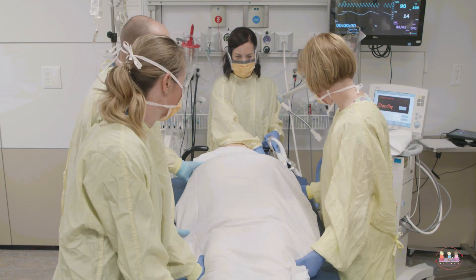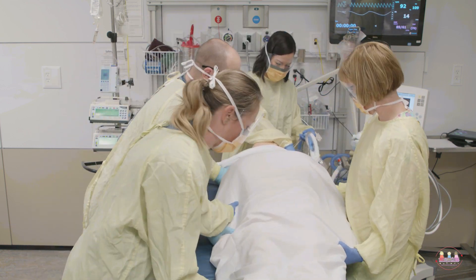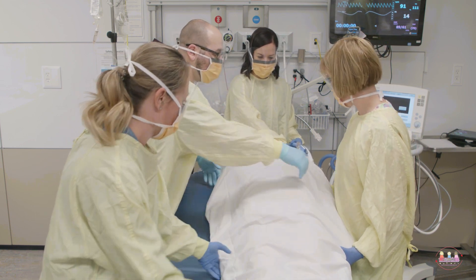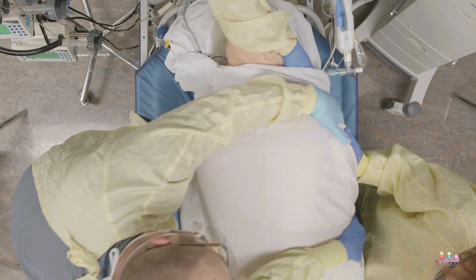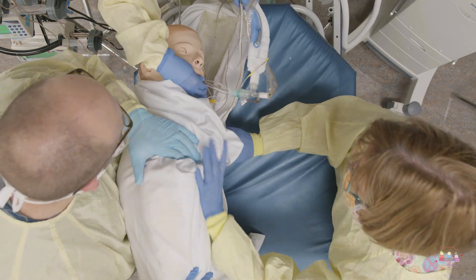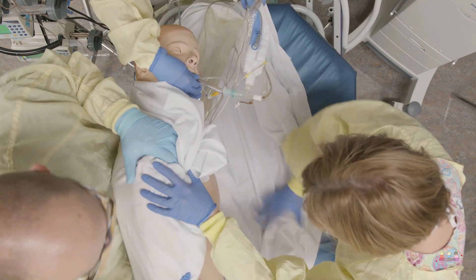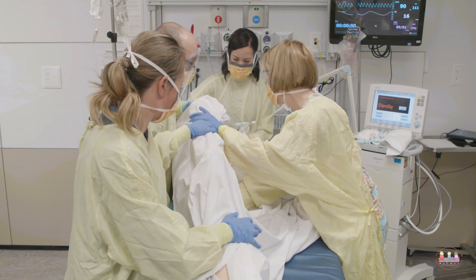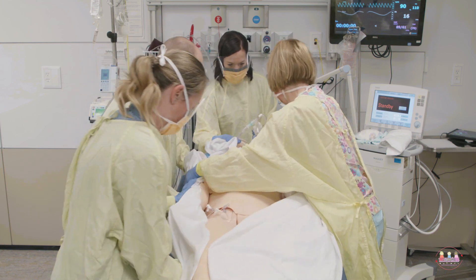Using all linens under the child, the bedside team slides the child to the edge of the bed towards the ventilator. The child is then turned 45 degrees away from the ventilator. The team pauses to reassess the child for comfort and physiologic stability. The child is then positioned supine.